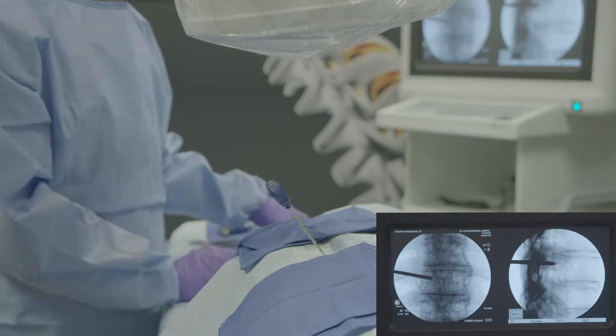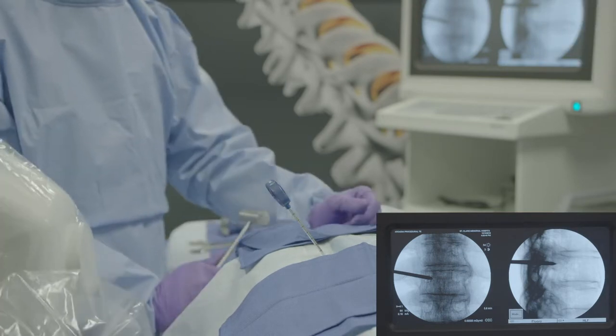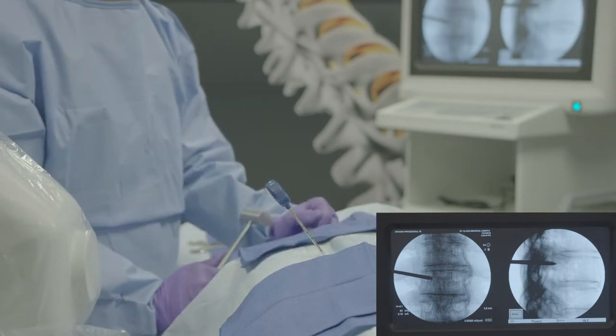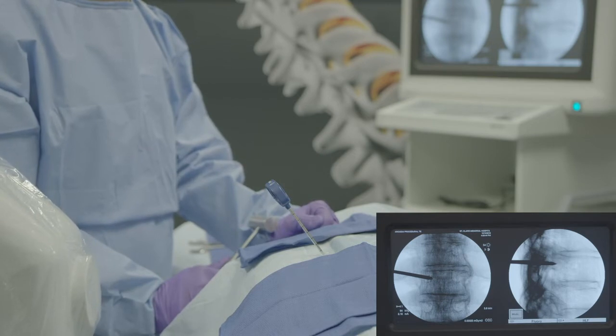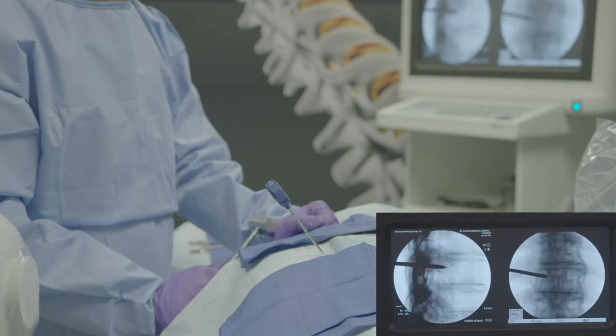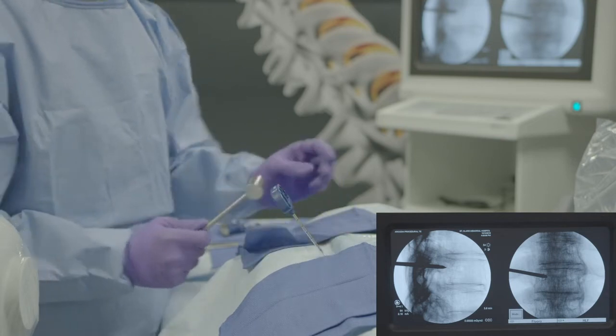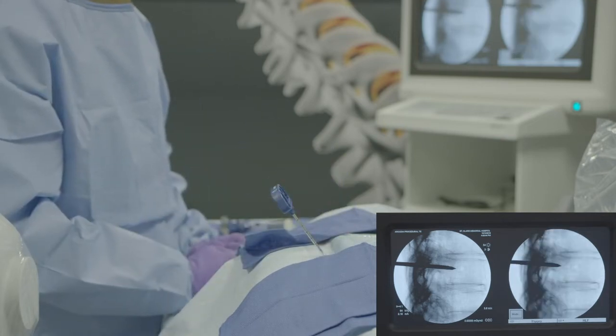Do not advance the access introducer beyond the medial border of the pedicle without verifying in the lateral view that the access introducer tip is at or beyond the posterior wall. In the lateral view, advance the tip of the access introducer to just before mid-vertebral body.